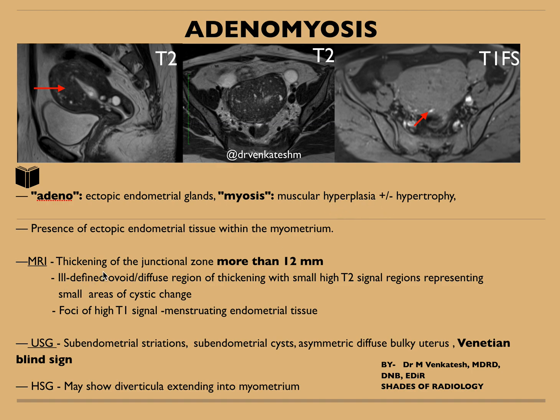On MRI, there will be thickening of the junctional zone. Here you can see the junctional zone is merged along with thickening of the myometrium, which is usually more than 12 mm, with an ill-defined ovoid or diffuse region of thickening. In this case, it is diffuse adenomyosis. Sometimes there may be focal adenomyosis, and the small high T2 signal regions represent small areas of cystic change. The foci of high T1 signal represent menstruating endometrial glands present within the myometrium.